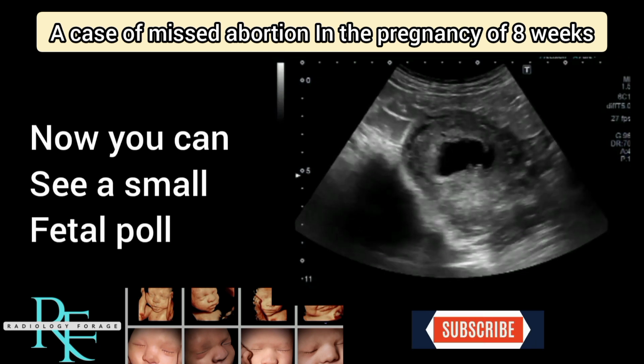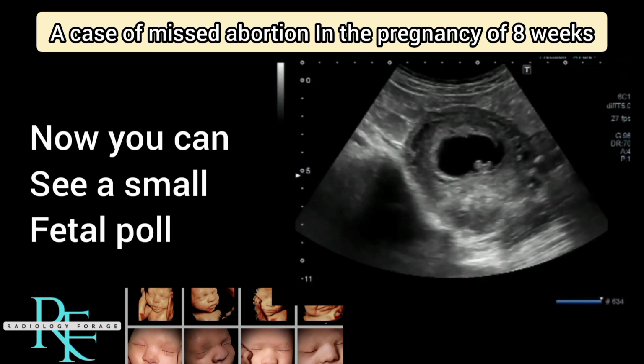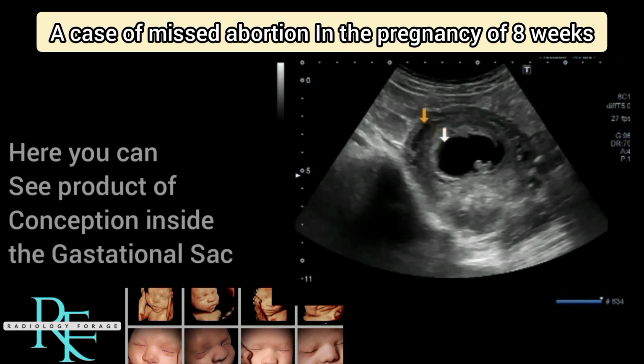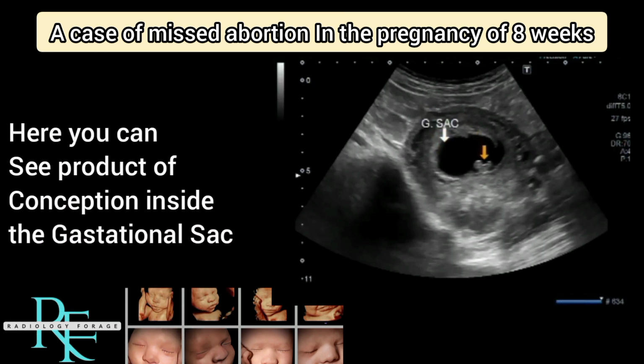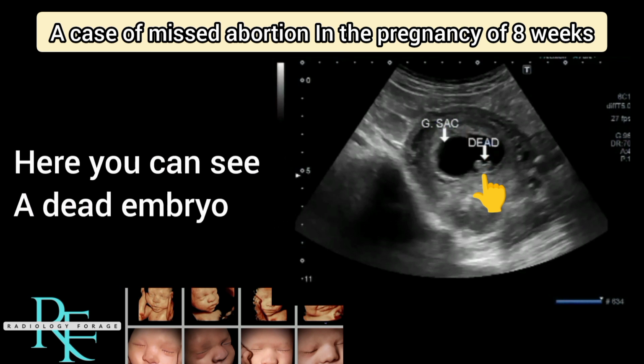Now you can see a small fetal pole in gestational sac. This is gestational sac and this is uterus and this is a small fetal pole. There is a gestational sac and there is a dead fetal pole. You can see it very clearly.